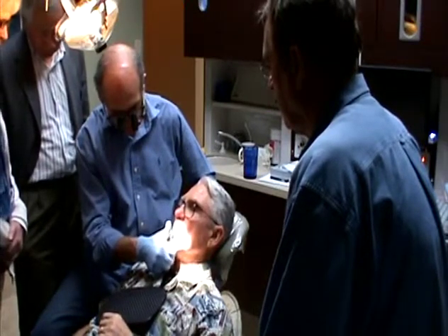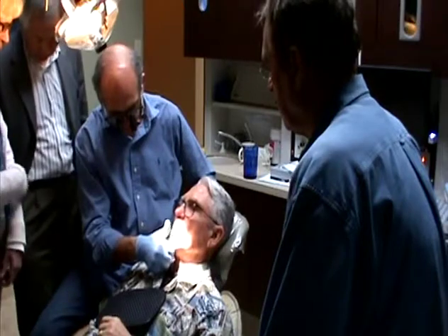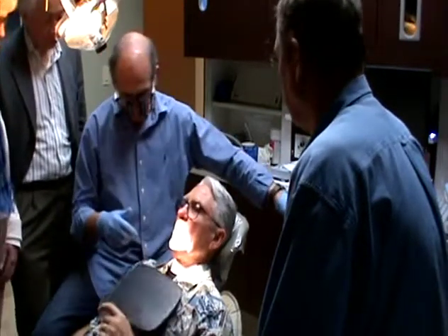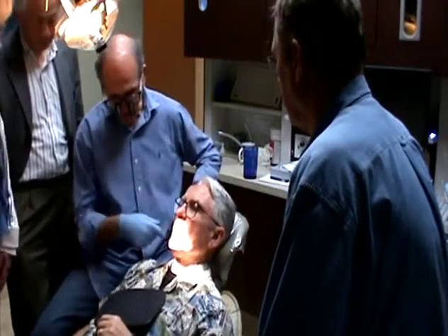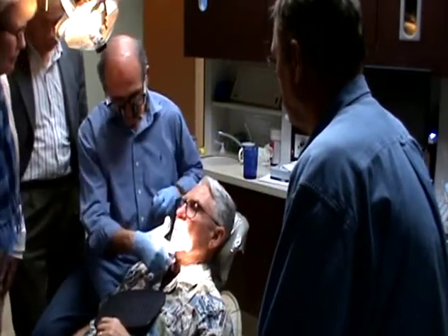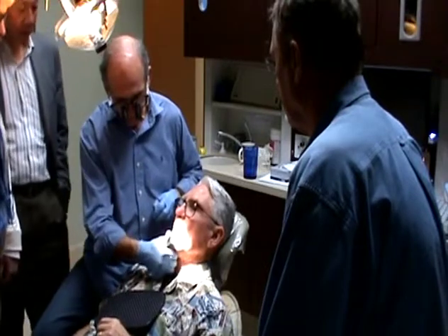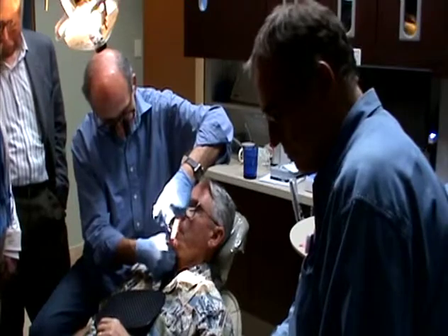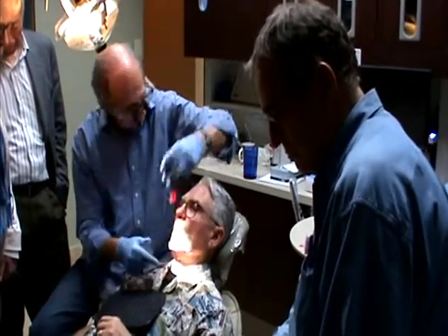You feel like I'm pushing you back? How's it feel on your occlusion? Still a little high, I'm only hitting on that side, I'm not hitting on the left side. 1 point on that side or the whole side? At 1 point, see there. Now you're pushing me back now. There you go. That's good.